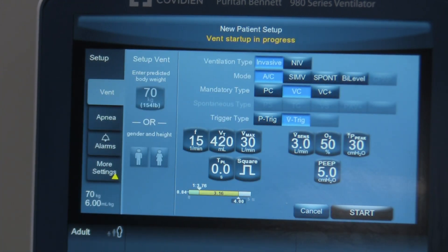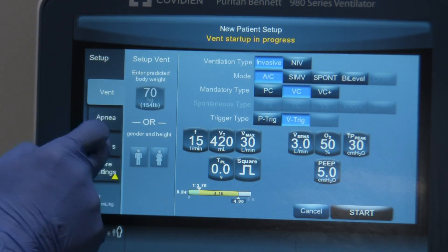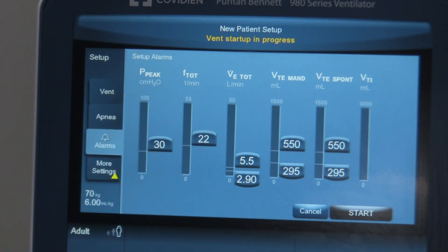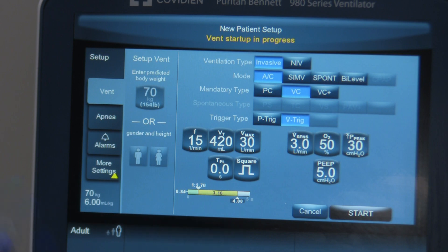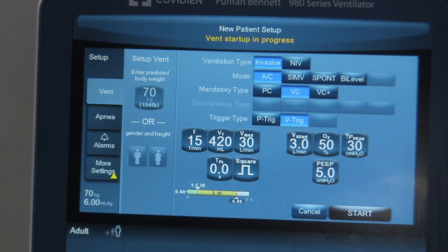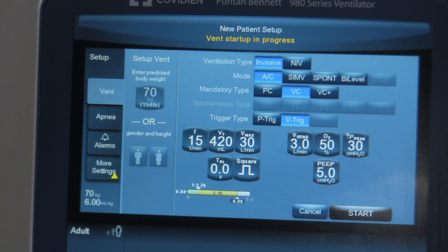We've set up the ventilator on our main screen and set some of our alarms. Now all we'd have to do is hit Start and we would begin ventilating our patient. Once you start ventilating, you can go back and readjust settings as required. Continue to assess your patient — set your ventilator settings according to the patient's presentation, clinical findings, blood gases, SpO2 values, etc. Make changes appropriately to stabilize the patient and eventually wean to extubation. Anytime you make a change, always go back and check your alarms to make sure they're still appropriate.